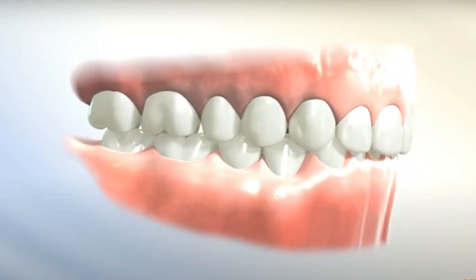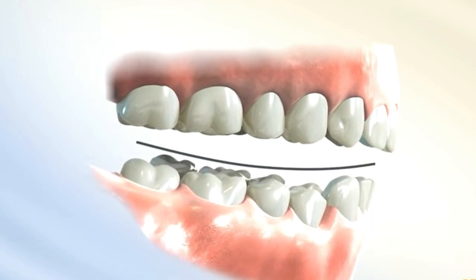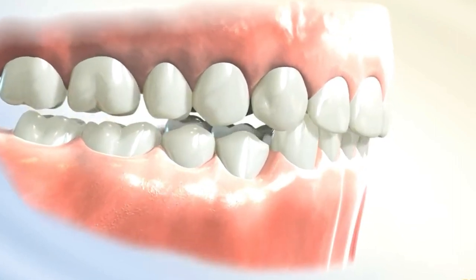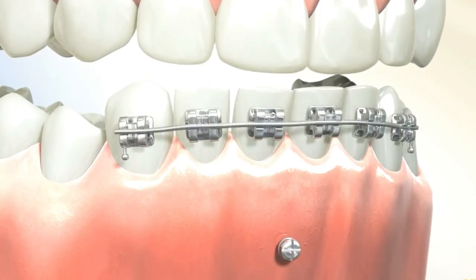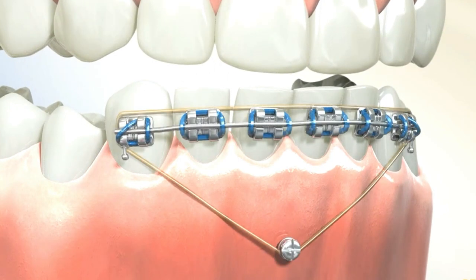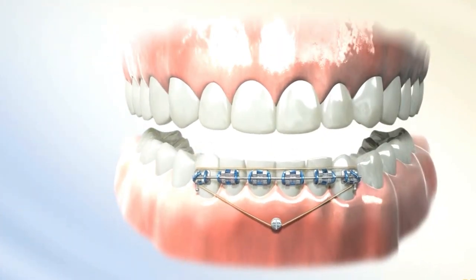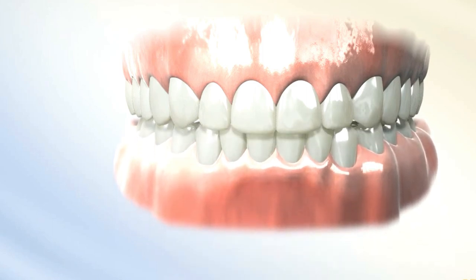The use of temporary anchorage devices, TADs, in deep bite correction with an increased curve of SPEE is a treatment approach that aims to address both the deep bite and exaggerated curve of SPEE. TADs are strategically placed in the jawbone to serve as stable anchor points. Once the TADs are in place, elastic chains are connected to the TADs and the brackets or wires attached to the teeth. These mechanics apply targeted forces to guide the movement of the teeth and help correct the deep bite and the increased curve of SPEE.